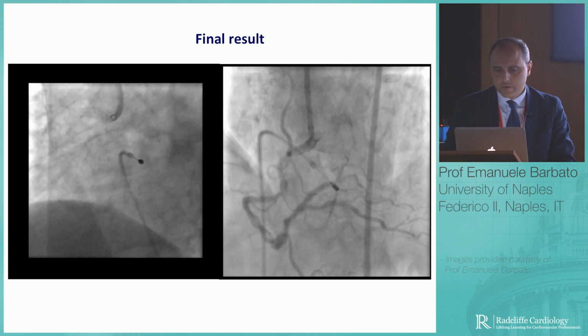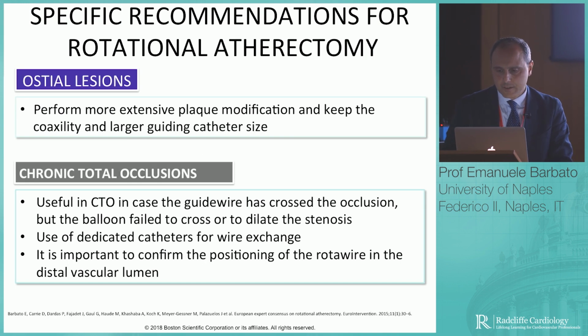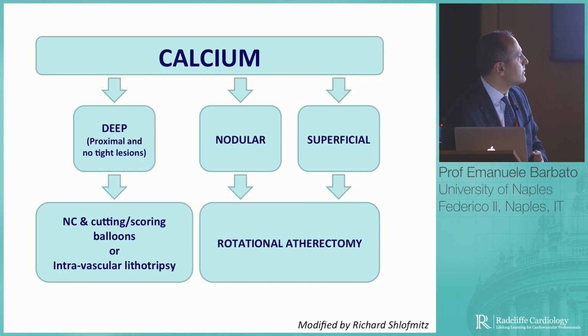In the same document, we also made some recommendation as it pertains to ostial lesion, but we just discussed them now. Management of complications. We can be here another 30 minutes, but I don't want to waste your time. This algorithm has been already mentioned before. I show you this slightly adapted algorithm here from Richard Shlofmitz, where we have put into the equation also the depth of calcification. Christos has alluded to it before. And where might be the place of each of the techniques currently available to treat the calcified lesion.